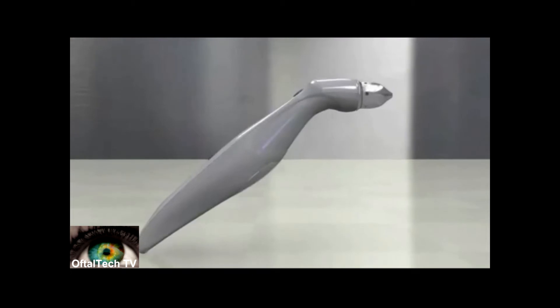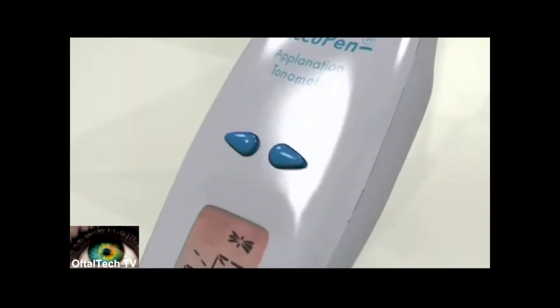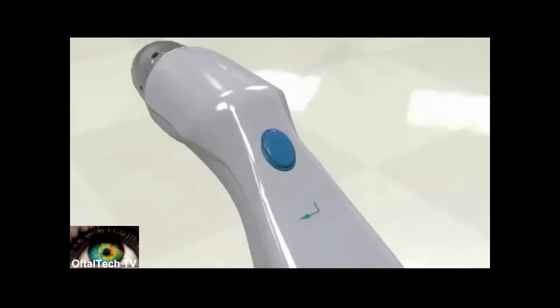To turn on your AccuPen, press any control button. The product information briefly scrolls across the screen. The measurement screen will soon be displayed.